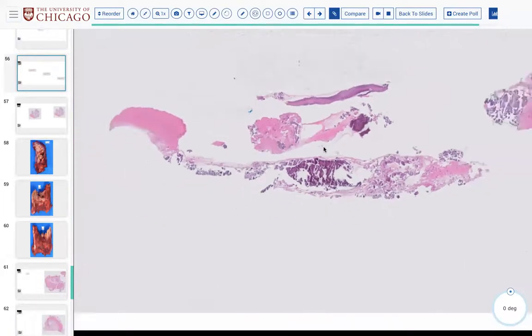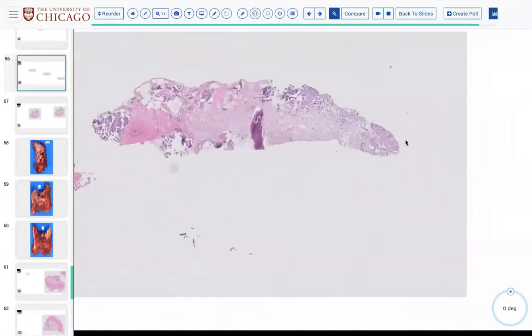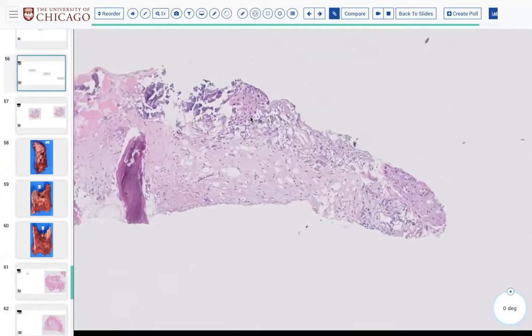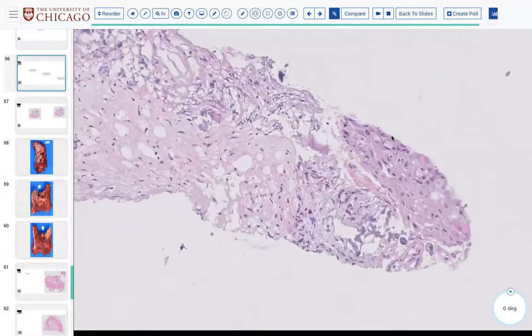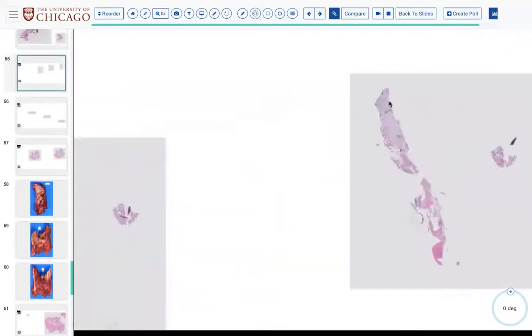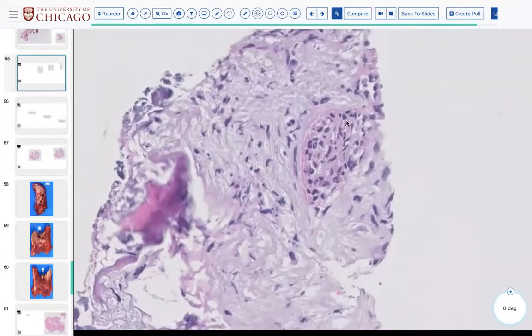And I can't blame that person. That was a hard call when you're not sure if it's detached or attached, and it's so maturing, so well differentiated. But then on the permanents, you say, oh shoot, that's atypical. And not only is it atypical, but it's now also embedded in desmoplastic stroma. So yes, this is a positive margin.